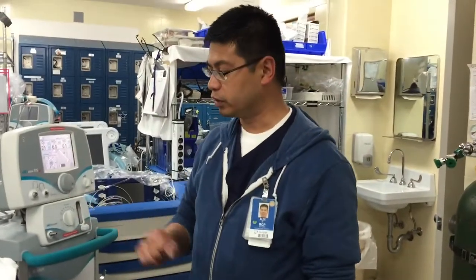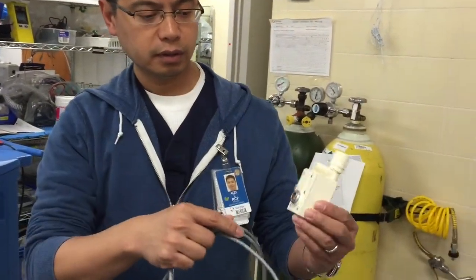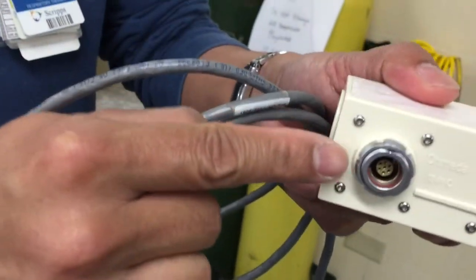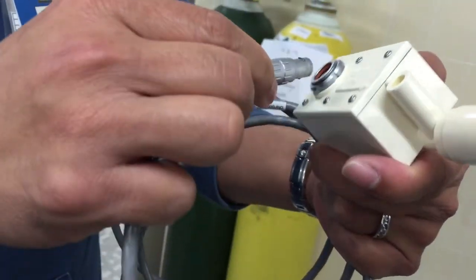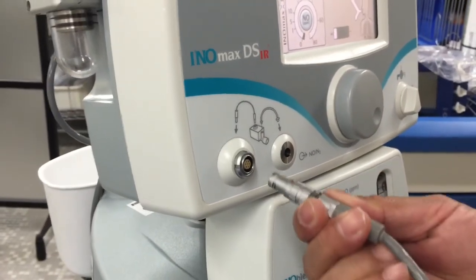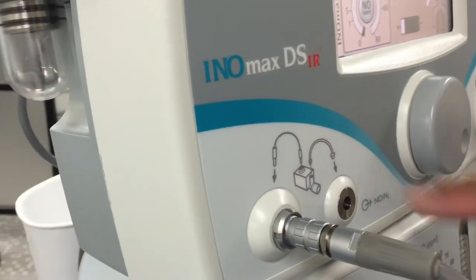Now let's put this whole thing together. You have your flow transducer and your flow transducer cable. You have to match the connectors inside — there's a little marker on the outside and a little marker on the inside that you have to match. Don't force it in if it doesn't match; it should just easily click. The same thing with the other end that goes into the machine. You can see there's also a picture there that tells you how it goes.